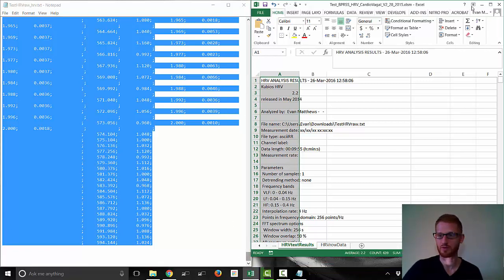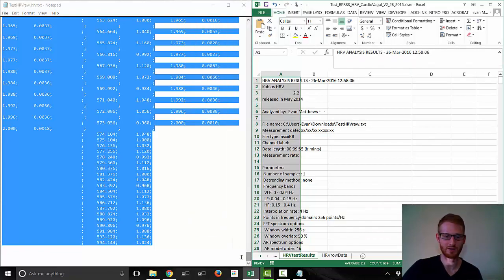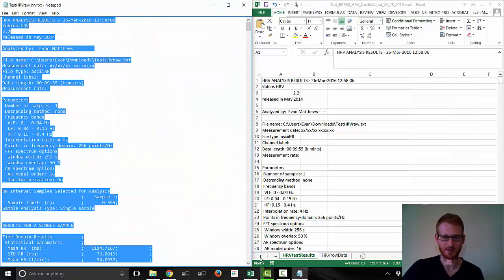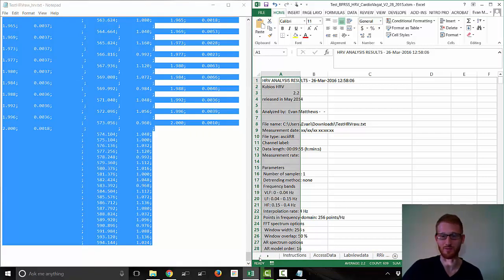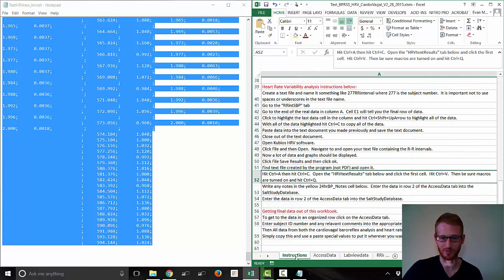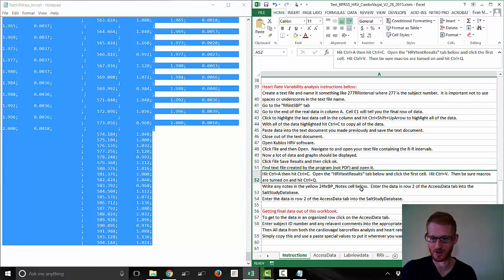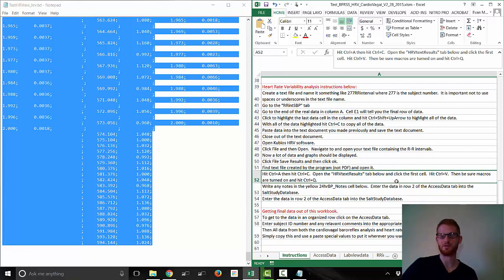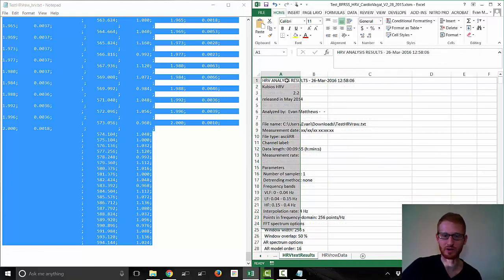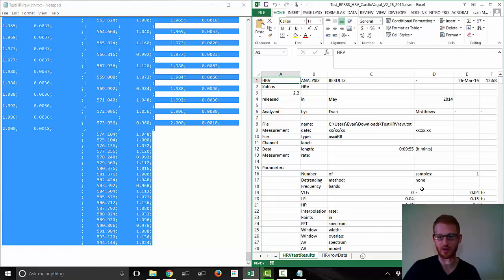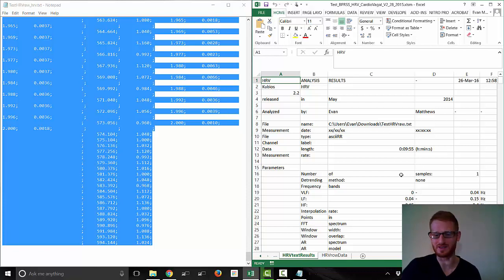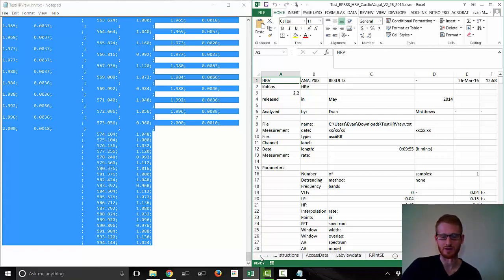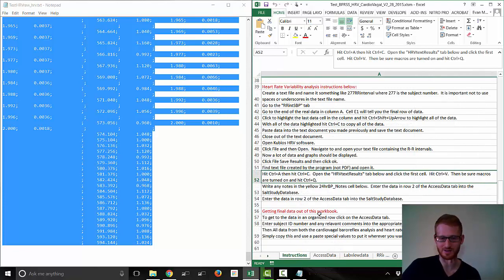We are going to paste this in the HRV text results tab. Right here, HRV text results, and just paste it in. Notice it all goes into a single column. That is going to be very helpful to us. What we need to do is have it shift around so it looks more like the PDF document. To do that, I created a macro, which is why you need to have the macros enabled when you open this Excel template. Click the first cell and hit Control-Q. That is going to activate the macro, which is going to move the data around. And now the template should be able to find all of that data.